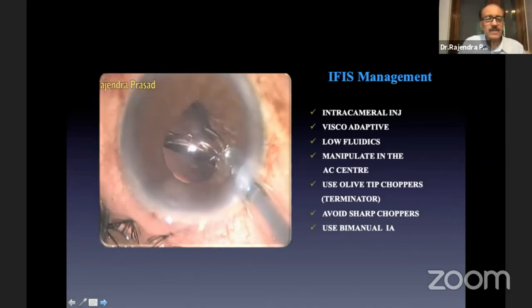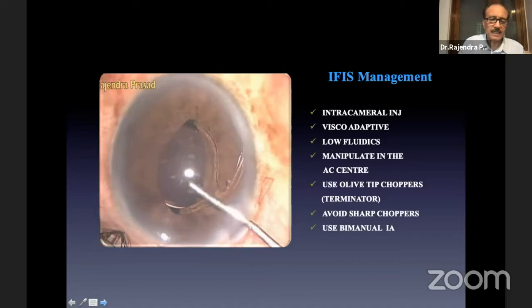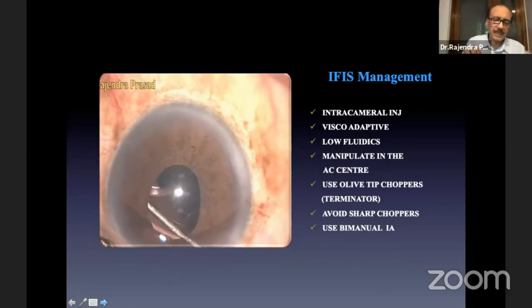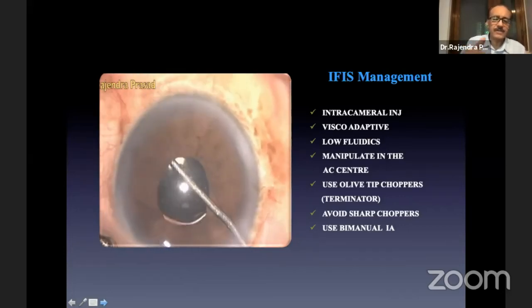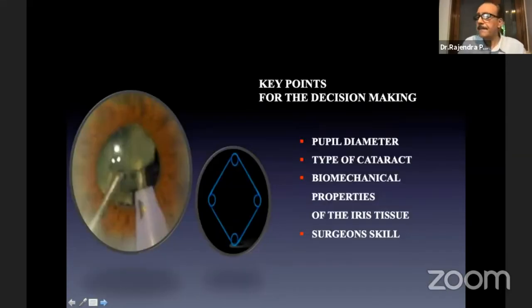Lens implantation is going to be a little difficult, because you have a lesser view of the rhexis as well as the capsular bag. But the important point is that your leading haptic should be inserted within the capsular bag. If you are able to put the leading haptic into the bag, then you can very nicely dial the lens into the capsular bag. So this is how I could complete this particular case without using any expanding devices, hooks, or rings.